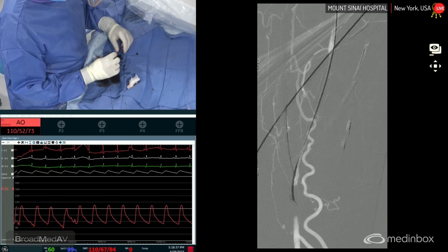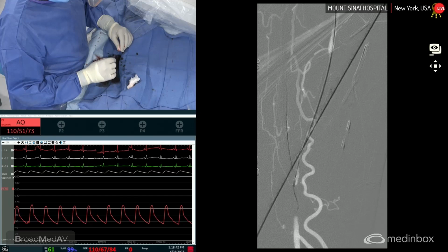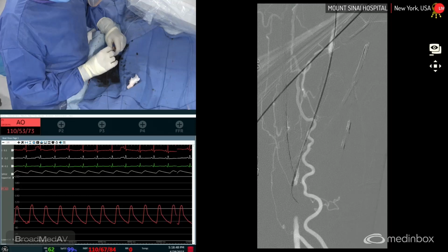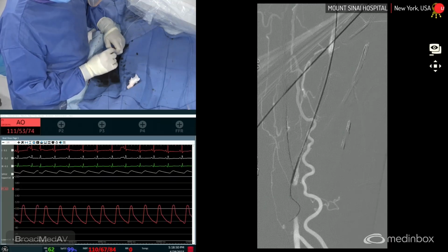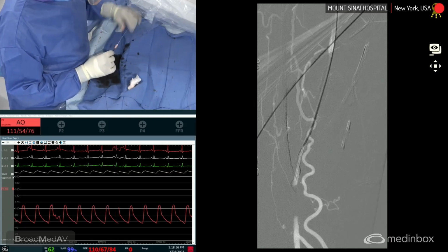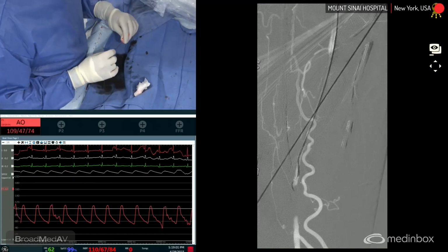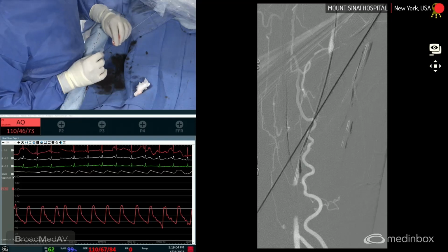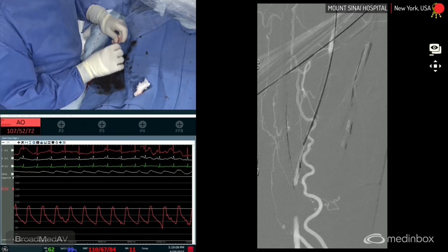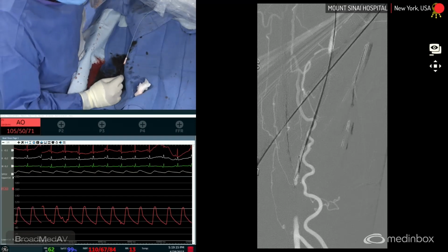I'm just reshaping the tip over here on this side, just to see how it behaves. It looks like we don't have a Connect 250T either. Sometimes these vessels are very difficult to deal with. So we're going to pull back again. I think the flow of the vessel is not very good, and because of that you have stagnation. That's why we probably have thrombus in this. Okay, catheter down now. I can do it. Don't worry.